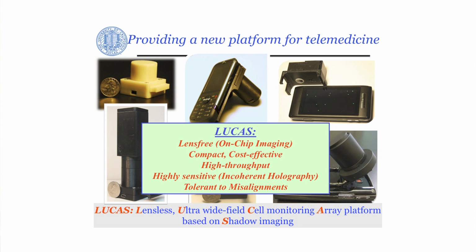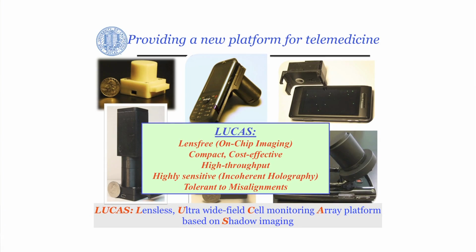And that's something we like because cell phones provide us unique access to computation wherever they work. So these are lens-free microscopes. There's no lens in any of these designs. It's quite interesting because you can still see even viruses at the level of a few hundred nanometers. As a result of the fact that they're lens-free, they're compact and cost-effective at the same time, and a unique feature is that they can look at very large volumes, very large areas, which is quite important. And the final thing is that these are tolerant to misalignment.